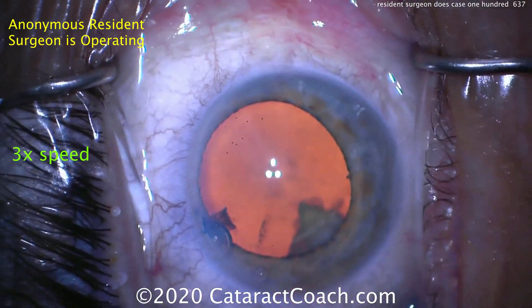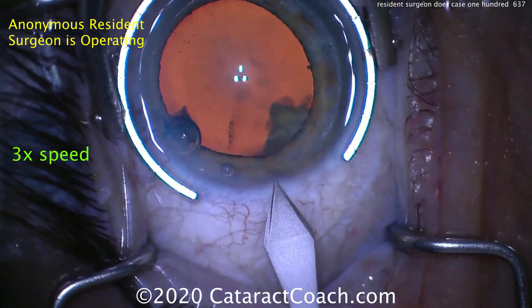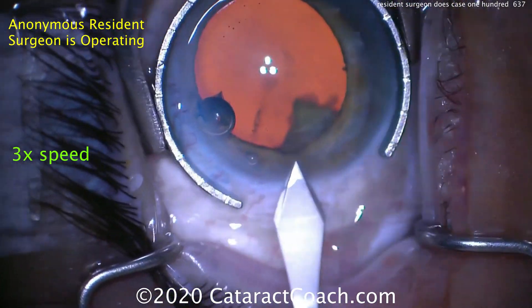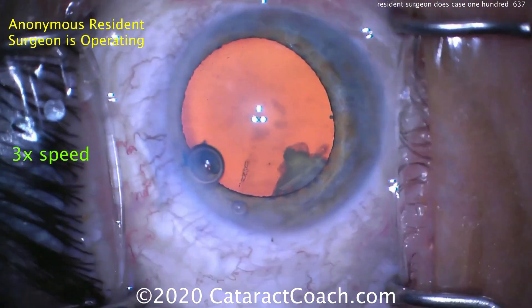Now let's watch as the main incision is being made. Looks like a right eye sitting temporally. The fixation ring is holding the eye. Here's our keratome — looks like a 2.75 or 2.8mm keratome. And the incision looks pretty good. Nice tunnel length. Reasonable construction. I like it.